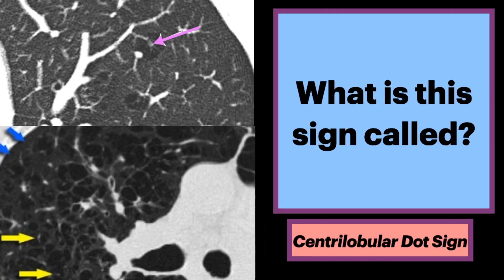Here are other examples. There are focal lucencies measuring up to approximately 1 cm, located centrally within the secondary pulmonary lobule, SPL. The arrows also point at a central dot, representing the central bronchovascular bundle.